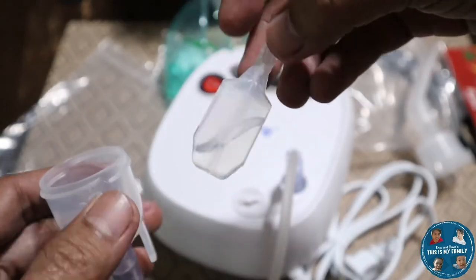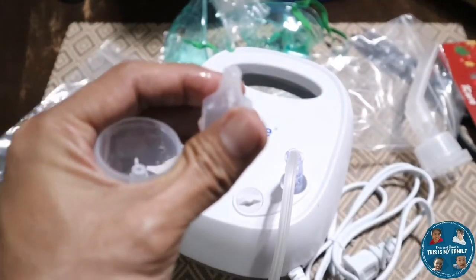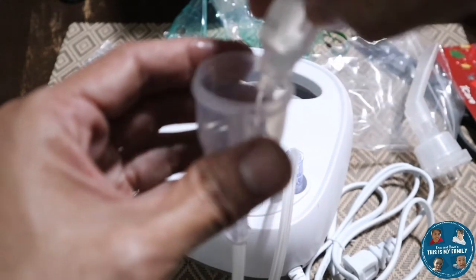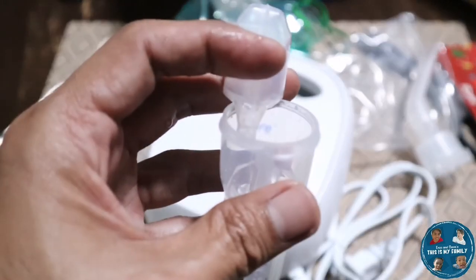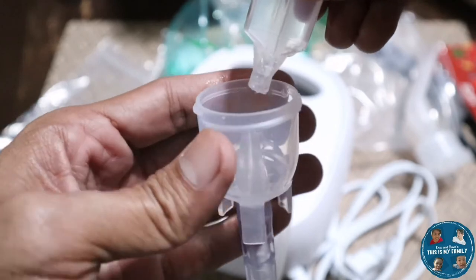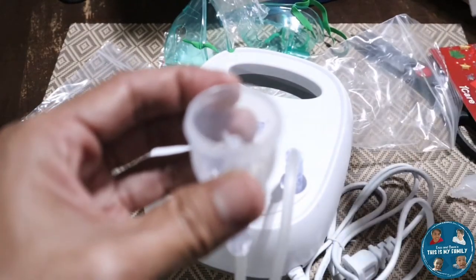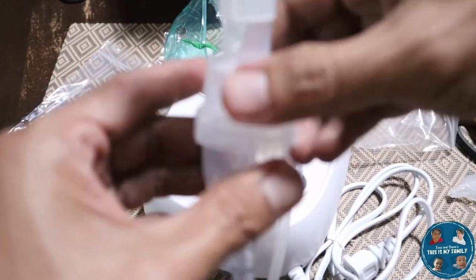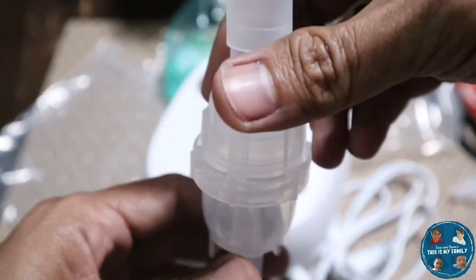So let's try putting a nebule. I will personally try using the nebule because I'm having a hard time breathing because of my cold and I don't want it to get any worse. It's very scary, especially this time of pandemic, COVID-19. So this is very handy. So let's close it up. Then let's see the mist.